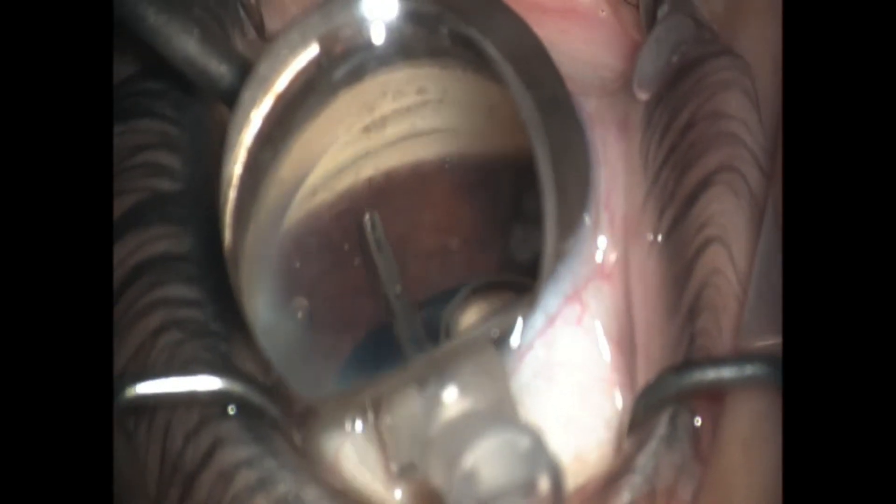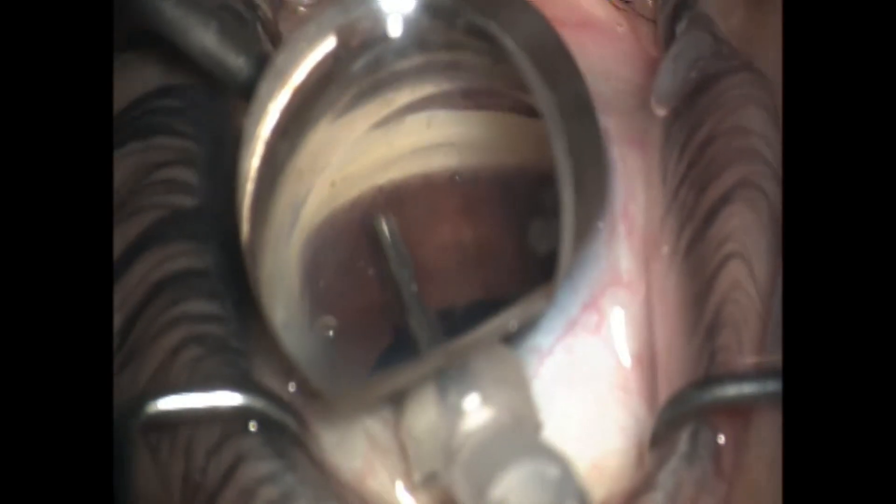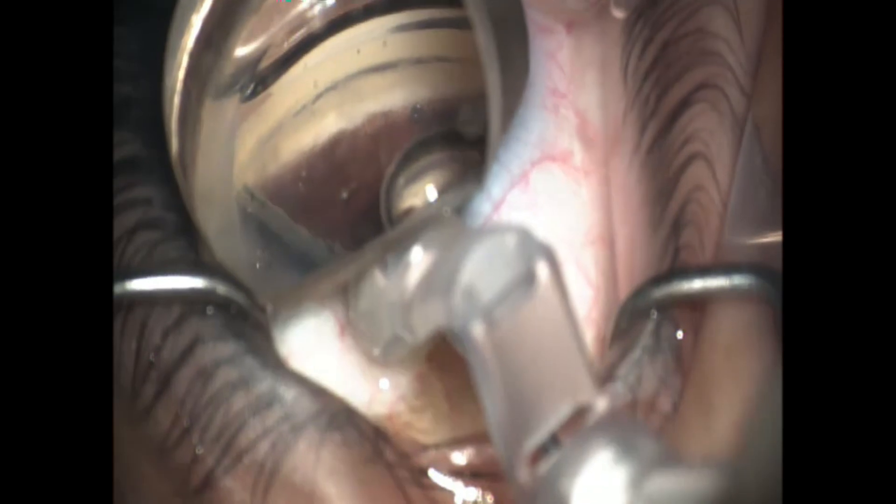Here I'm going to rotate that stent down and use the trocar from the injector itself to pick the stent up, as you can see. Then I'm going to move it right back into the location where I want. And because it's the Infinite, I have as many times as I want to be able to push down on this injector and try to reinsert that stent — and that's what you're seeing right here.